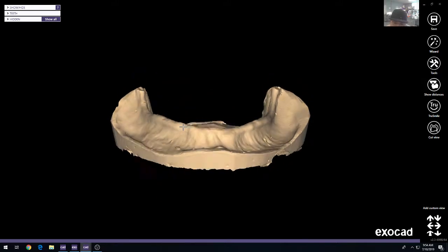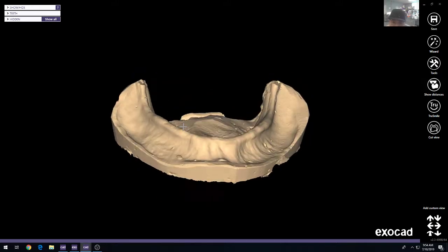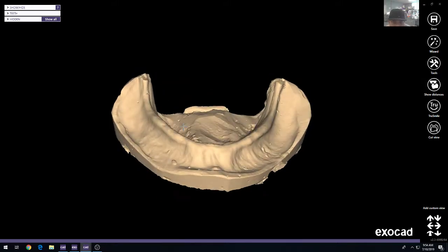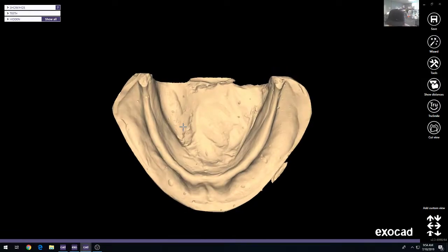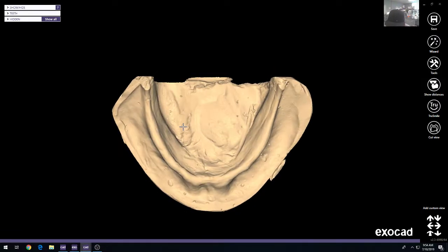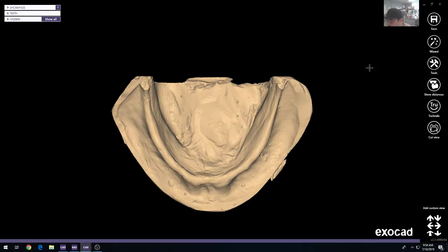I know it's kind of a basic concept, but something that should be covered in every 101 type of experience inside of ExoCAD. So the first step in the process is to load the data.